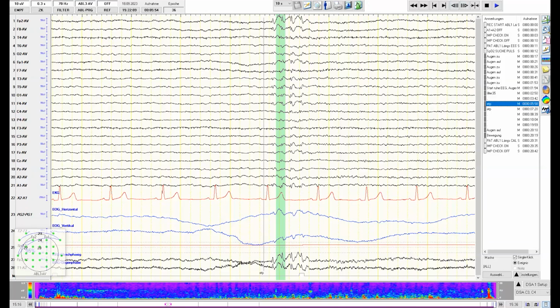Hi, Sebastian. Thank you so much. Just a question: when you showed the presentation, the EOG wasn't differentiated between horizontal and vertical, and in this EEG with the EOG, you have that differentiation. Is that always the case that you can separate that? Is there also separation between left and right?